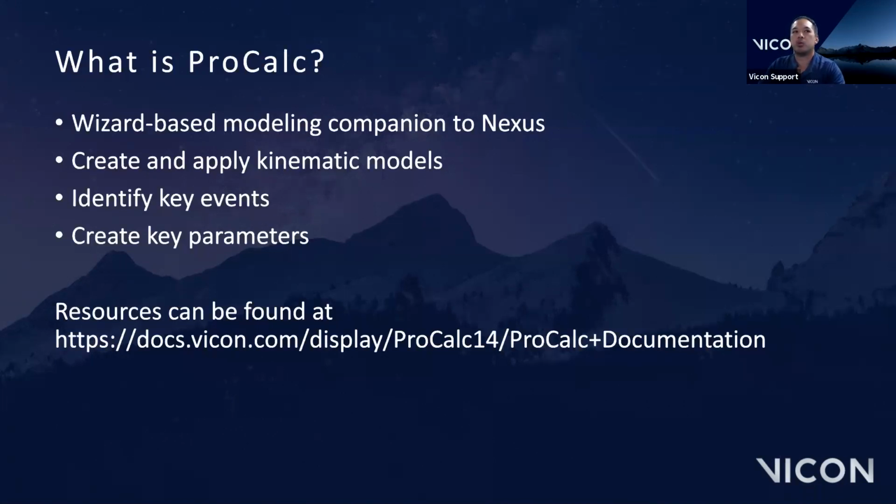And the important thing is a lot of these resources can actually be found at the website located down below. The easiest thing to remember really is the docs.vicon.com down here at the bottom, and then you can navigate to where you might find that ProCalc documentation.